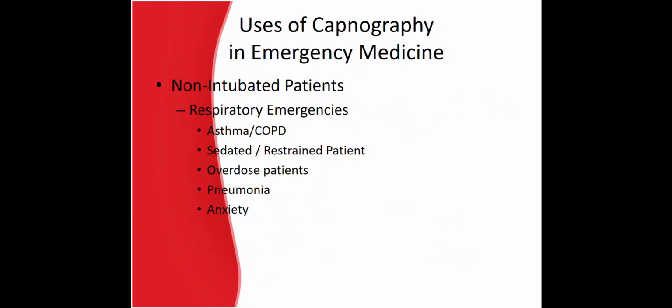Capnography can also be used on routine, non-intubated respiratory patients for the following types of cases: asthma or COPD, sedated or restrained patients, overdose patients, pneumonia, and anxiety.